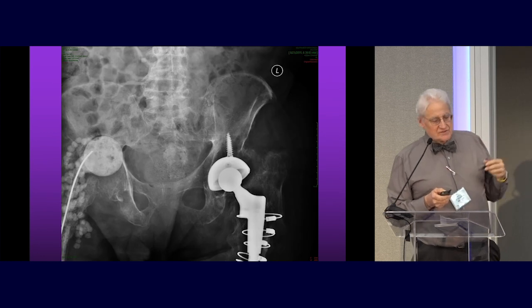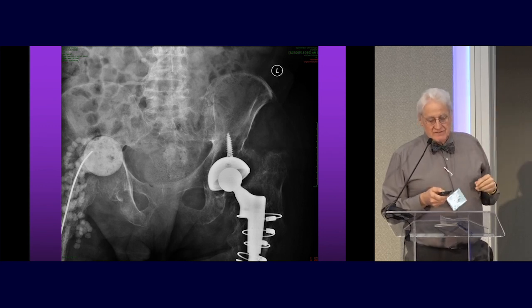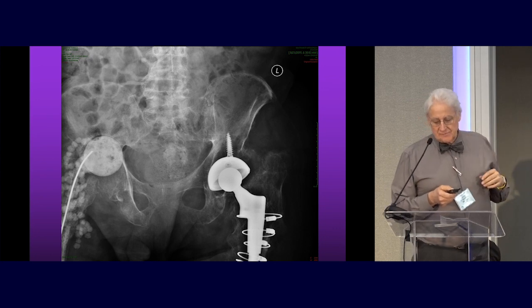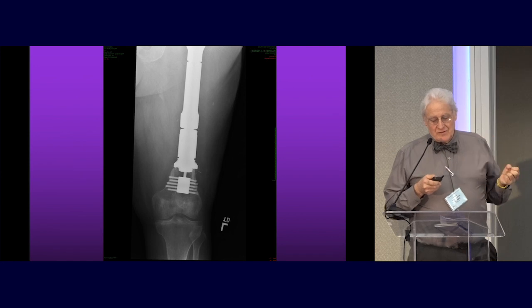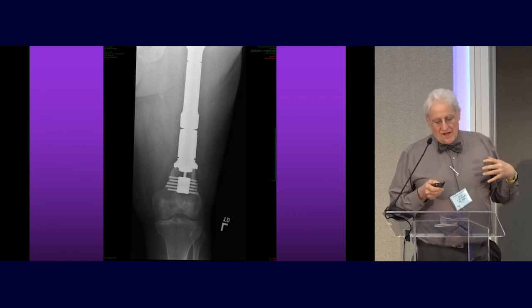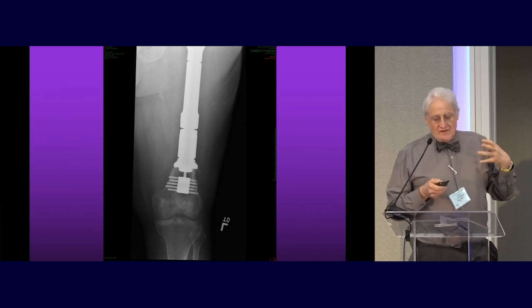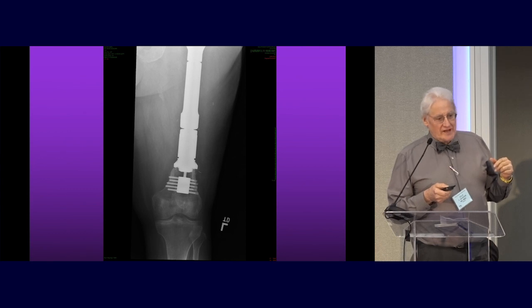And essentially that's what it looks like in the body with the antibiotic beads as well. And usually I use 2 bags of cement with 6 of all of those things, so that I can make beads as well as a spacer. This is a gentleman, just to show you the problems. So many debridements. Even before he got to me, they still had problems. Eventually we got it clear, but look, this is all of his femur he has left.